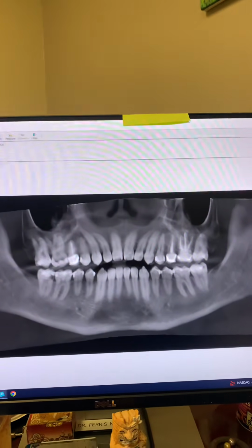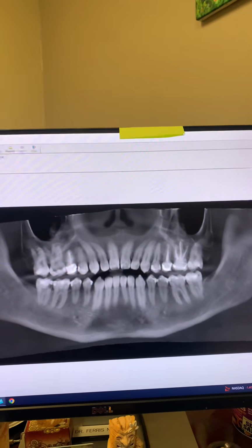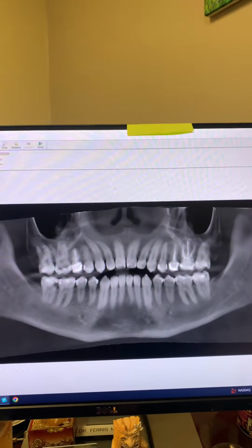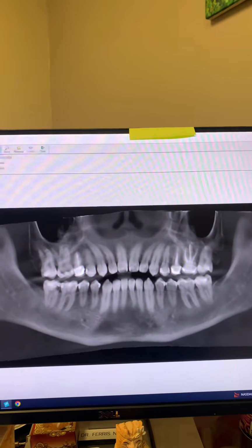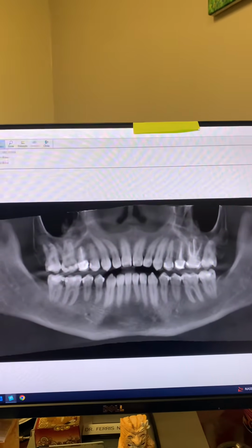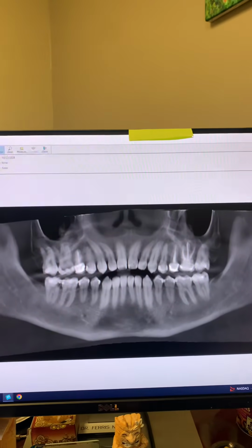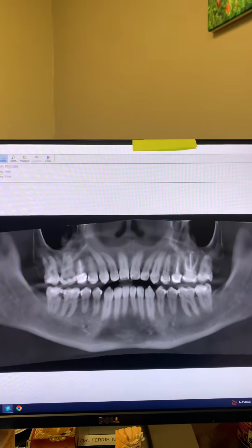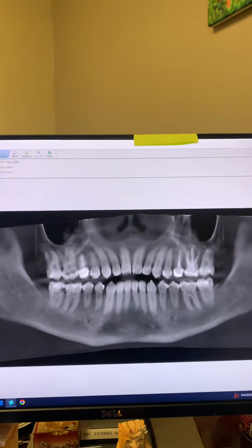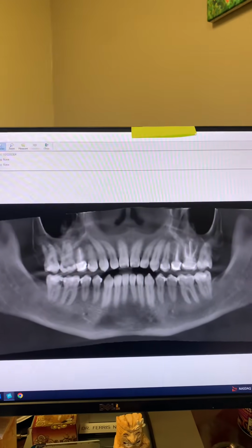I've had many times my followers DM me with a panoramic radiograph such as this one, and they wanted me to tell them whether or not a tooth needed a root canal or not. And I'm talking about patients that you can actually take intraoral radiographs of. But for whatever reason, they went ahead and did a panel on them.